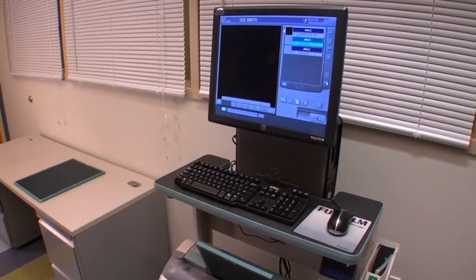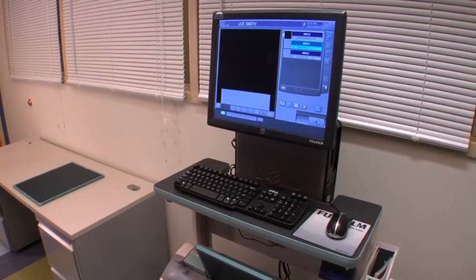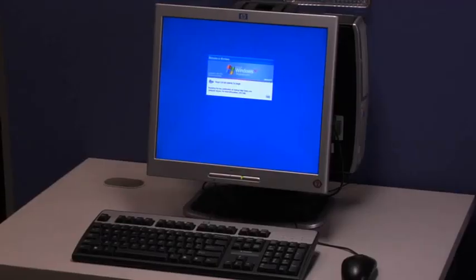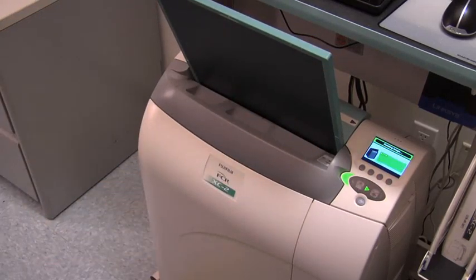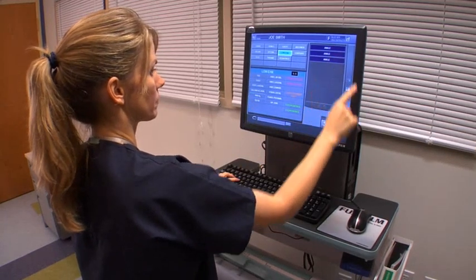Conventional radiography, using film and intensifying screens, is slowly being replaced by computed radiography. This involves a digital image acquisition system and includes all of the equipment used for conventional radiography, as well as the following: imaging plates and cassettes of varying sizes, a technologist workstation, which includes a computer system, an image plate reader or processor, and a picture archiving and communication system, commonly known as PACS.